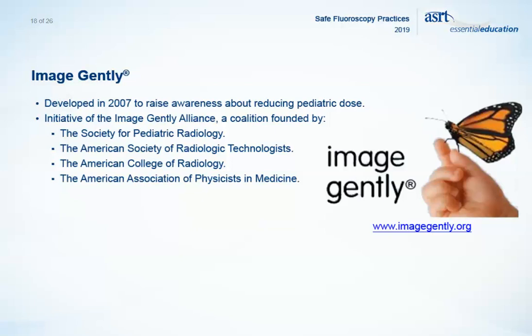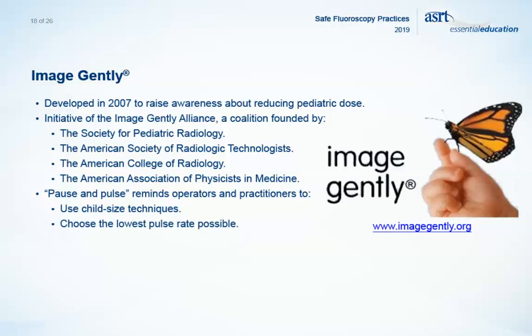For fluoroscopy procedures, the phrase pause and pulse reminds operators and practitioners to use child-sized techniques, choose the lowest pulse rate possible, and consider alternate imaging modalities such as ultrasound or MRI when appropriate. Thousands of healthcare professionals and facilities have taken the online pledge to image gently when performing pediatric imaging exams.